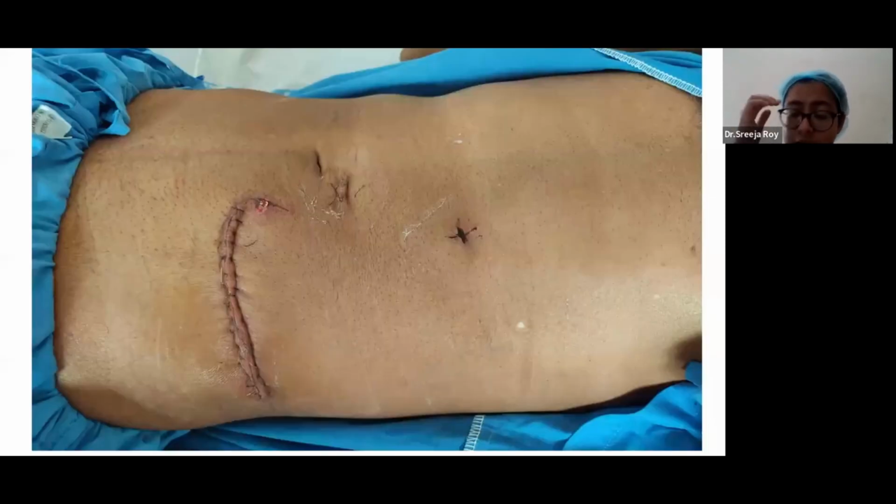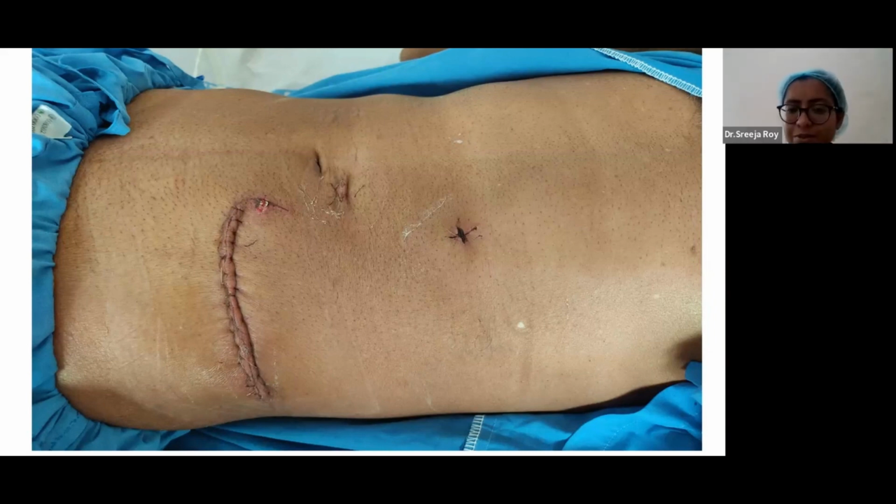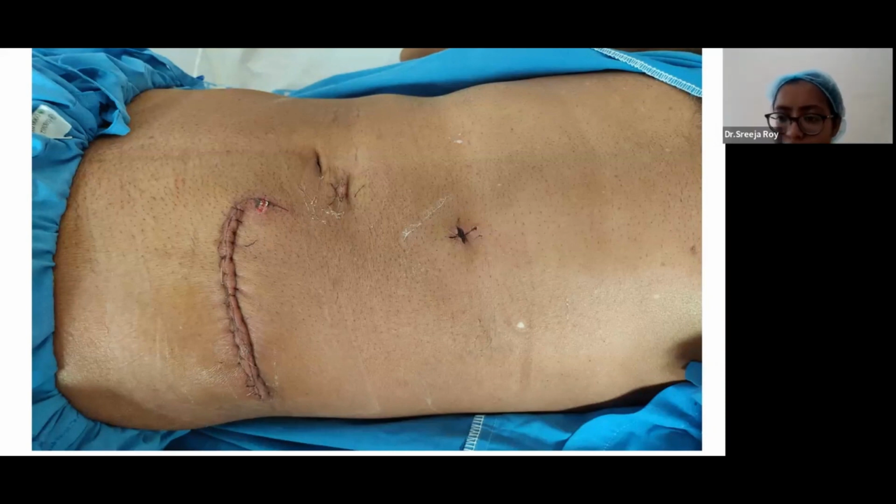How is the ureter dealt with? Is there any difference from the open approach? Actually, in case of laparoscopy, you should not resect the ureter first. You identify it first, and then use it as a guide and for lifting the kidney. It will help you lift the kidney up. And you should not resect it at the beginning. First the kidney is mobilized, then we will resect it.